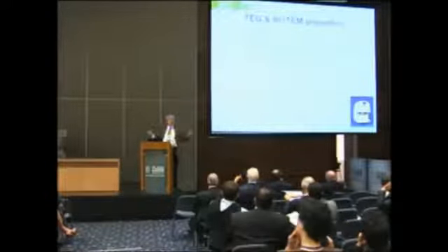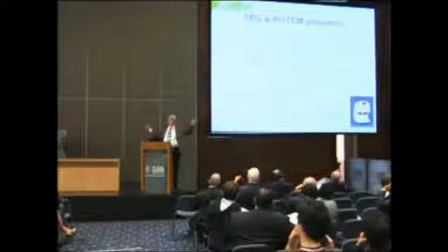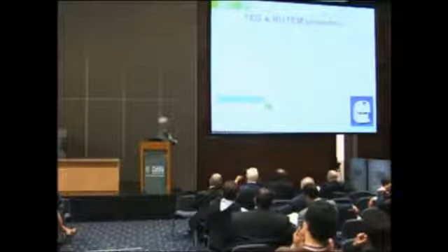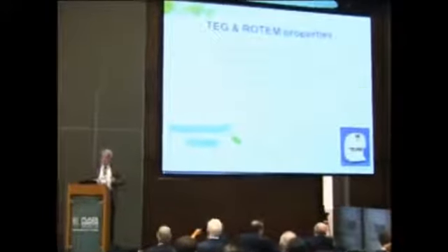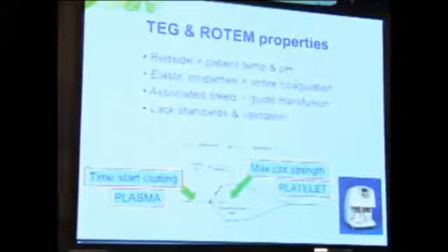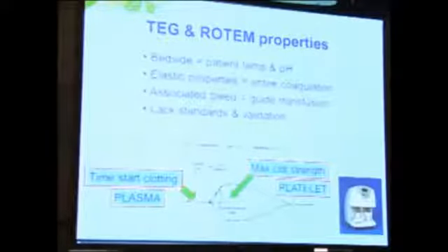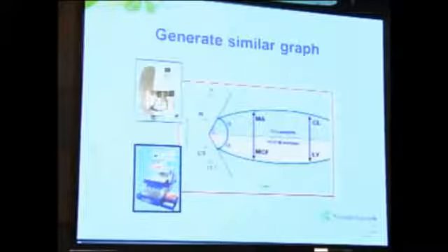Second thing, it can be done at the bedside. You don't have to send the blood to the lab to have it done and wait for 1 hour until you get the result. And then the other beautiful thing about this is that, let's say it's taking too long to start clotting. It also tells you, look, you can correct this. Give plasma to this patient. So let's say, in another situation, the clot, as you see here, is too weak. It's a wimpy clot. What does that mean? It means the patient needs what? Platelets. Very good. So it means the patient needs platelets or fibrinogen, in fact. So you know, depending on the problem, how to treat the coagulopathy that you're diagnosing. So not only do you diagnose the coagulopathy, but you also know how to treat it.